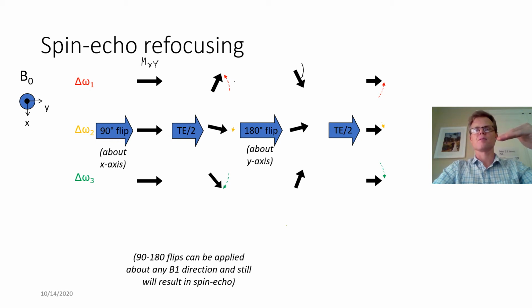It gets flipped around, continues to move slightly clockwise, ends up at the exact same horizontal orientation that it started at. And then the green on the bottom line, again, it's doing the same thing, but rotating in the opposite direction as our red top line, where it's rotating clockwise because it's at a different resonance frequency, different magnetic field. It's flipped over, but continues to rotate in this clockwise direction.